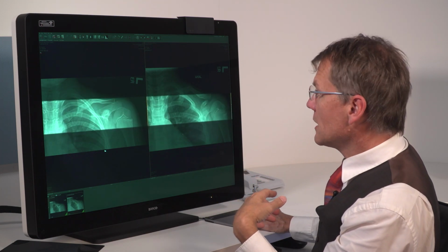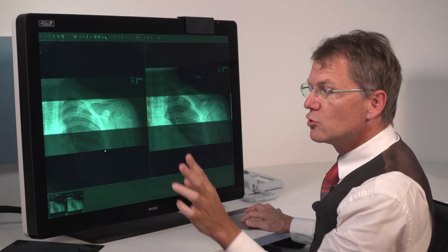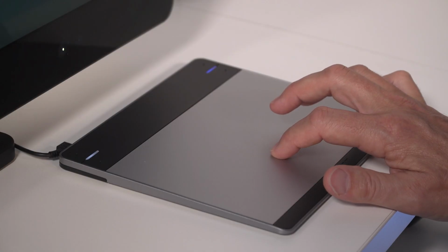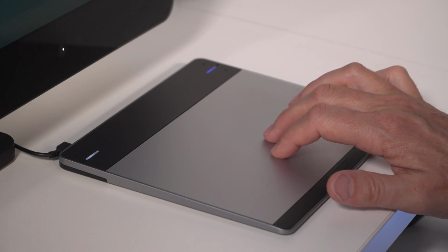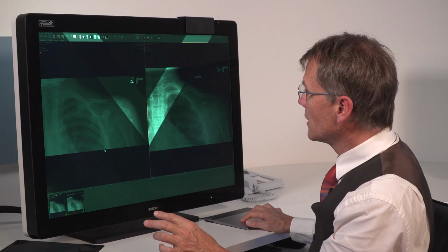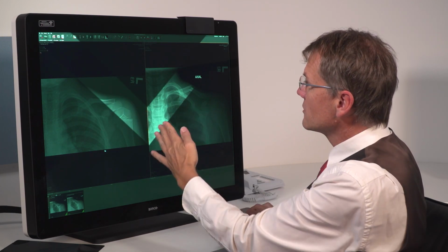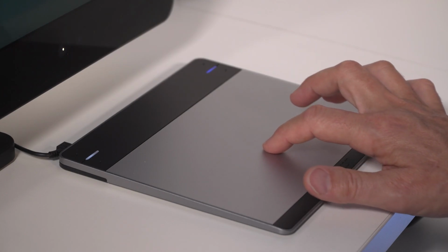You can single tap, and you'll get the magnified view in a bar. And when you have the bar up, if you put two fingers more down, a second and a third finger, that will enable the V mode. And now when you change the angle with your two fingers, it changes the angle of the bar, but the bar is reflected to the other side. And so with a single finger, you can still move it around.